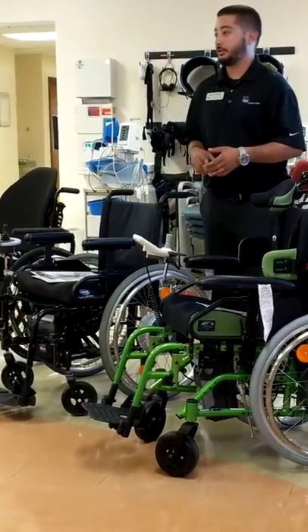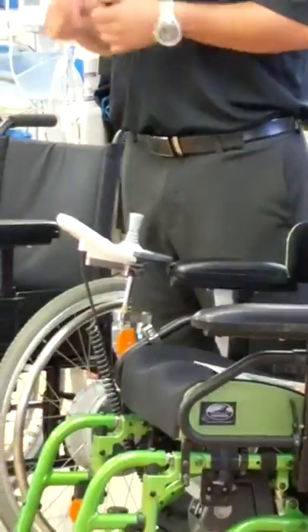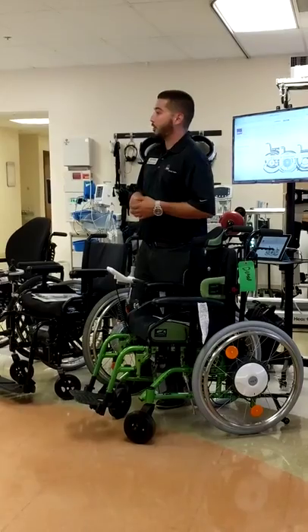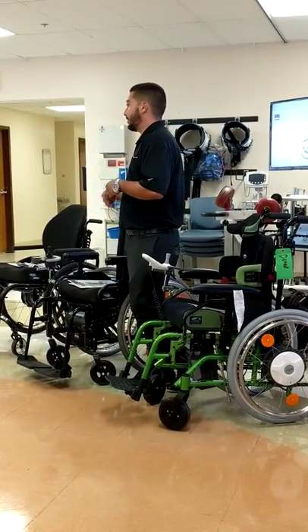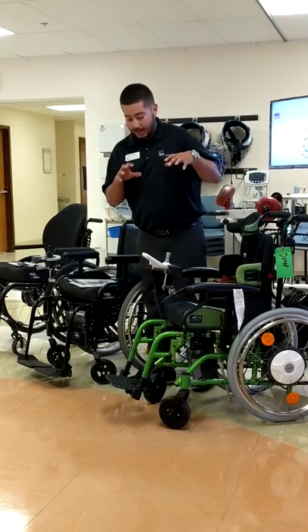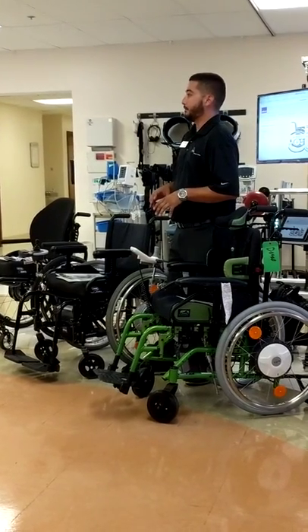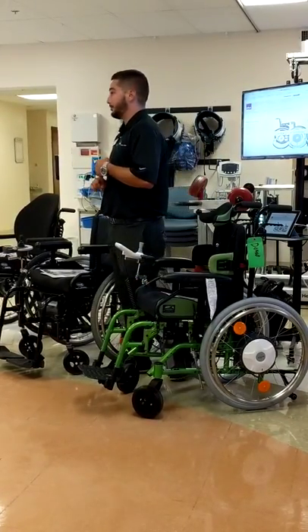We'll start off with eFix. eFix is a power add-on system. We can turn any tilt-and-space chair, any manual chair — whether it's a folding chair or rigid — into a power chair. So if you have someone who has an issue with transporting a power chair, maybe they don't have a way of getting it back and forth, and they want more of a lightweight solution but still have that power option, eFix would be a good solution for you.